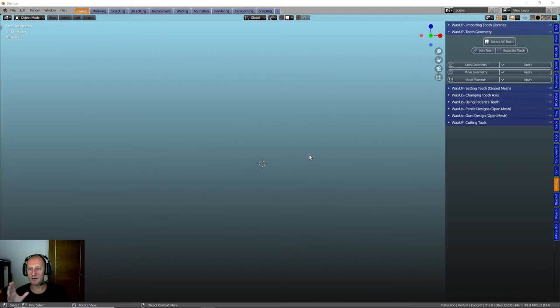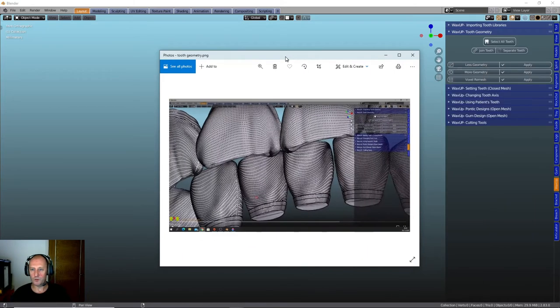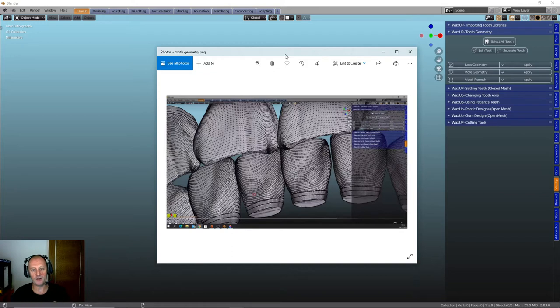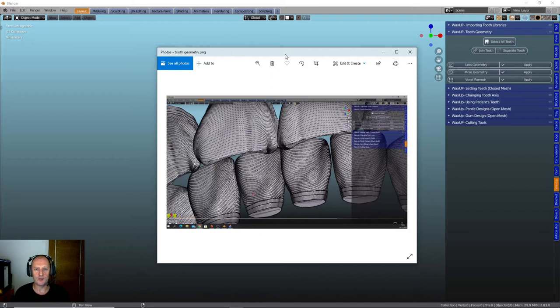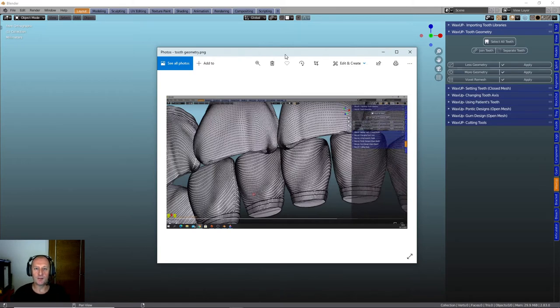The next one we're looking at here is the tooth geometry. Now, this is what I was talking about when we were saying you've got a lot more scope to do stuff. Now, what we have here is a way of taking the teeth and remeshing and playing around with the structure of the mesh to create surface texture and change of the teeth. And this is how you can bring in different types of tooth from different libraries and you can unify that mesh depending on the outcome. And that's one of the big things about this. You have to realize and you have to remember what the outcome is at the end of it. And that will depend on how you work with the mesh and what you do with the teeth.